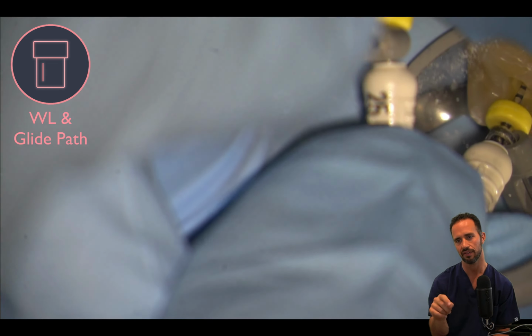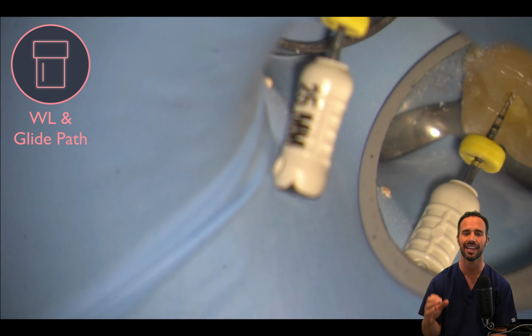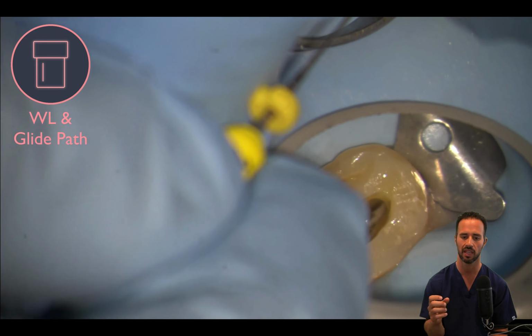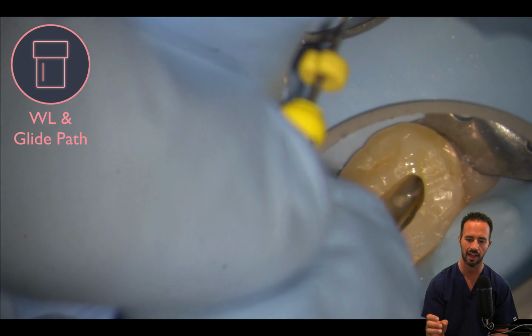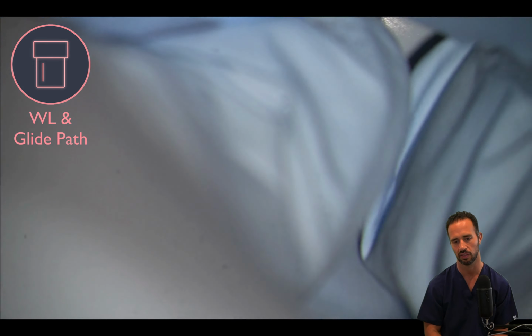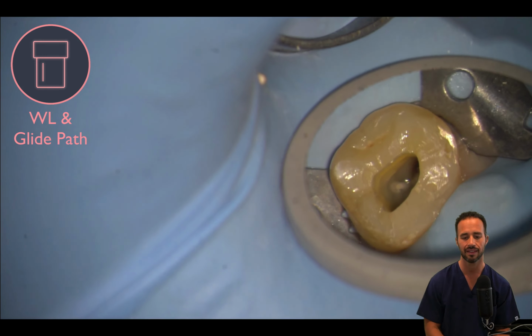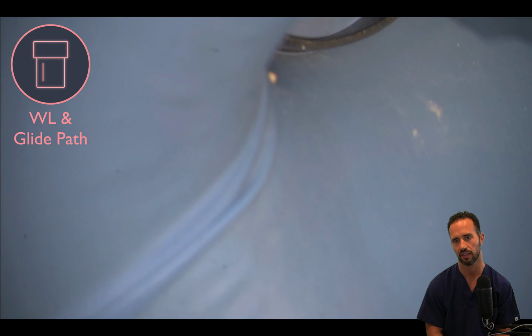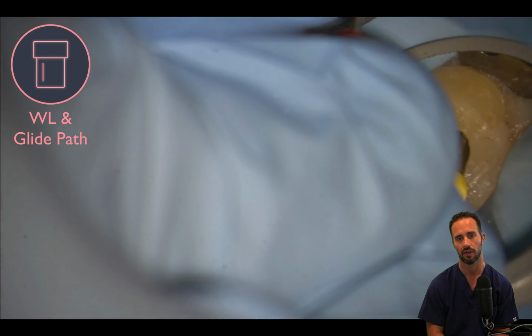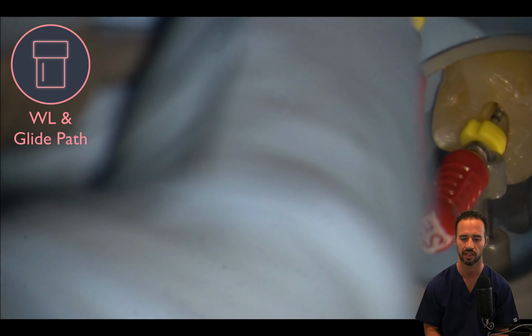If you have a tiny file in a very large canal, your apex locator is going to be very inaccurate. And so you want to find a hand file that is going to be a snug fit in that canal to have a much more accurate reading with your electronic apex locator. So I'm going up, up, up, up, up. I'm going to end up determining my working length with, I believe, a 30 hand file, which is obviously much bigger than most canals where you determine your working length with.